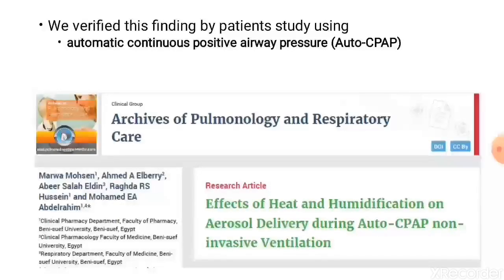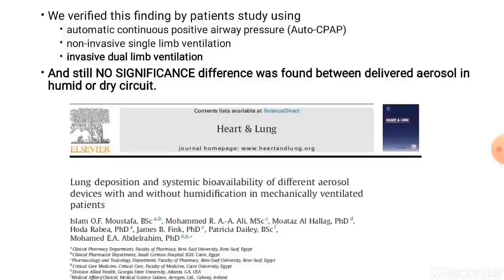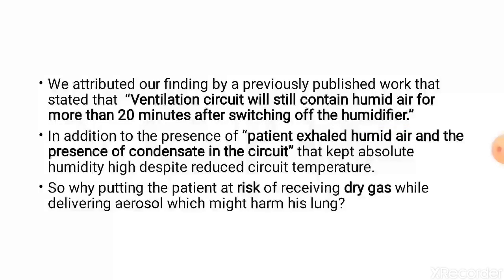When we used it with CPAP, no significant difference. When we used it with BiPAP, single limb, no significant difference. When we used it with invasively ventilated patients, dual limb, no significant difference. We didn't even find any significant difference in the clinical state of the patient getting the dose by dry circuit or humid circuit. We attribute our result to the ventilation circuit continuing to hold water or humidity for 20 minutes after we switch it off. Besides, the patient's exhalation has water as well.